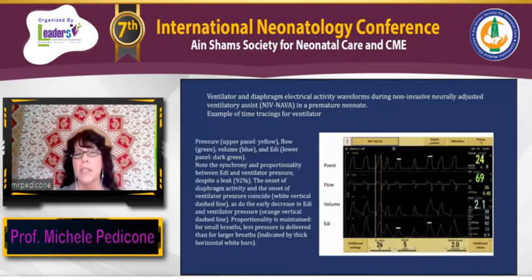So here is a screenshot of the face of the monitor, to try to explain a little bit better. The upper tracings are pressure, flow, and volume, and then the bottom one right here is the EDI level. So note the synchrony and the proportionality between the EDI and the ventilator pressure. Every time the ventilator pressure is higher, so is the EDI.